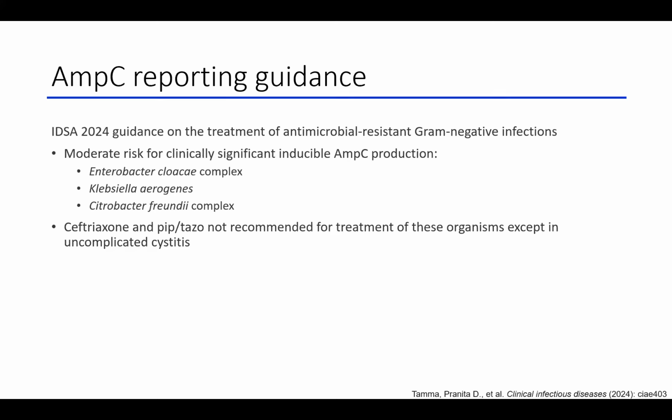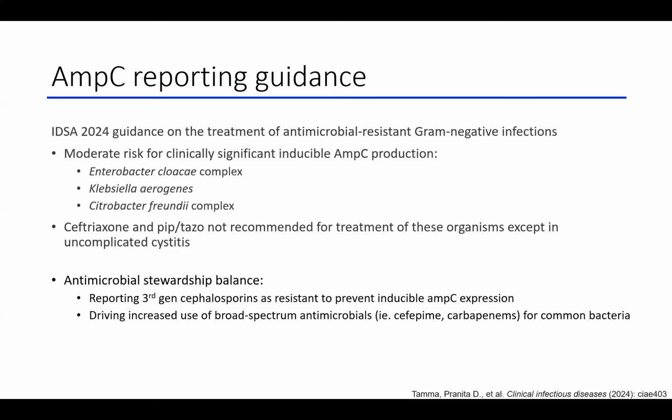So that goes to show that we treat the specific AMP-C containing organisms a little bit differently than the entire list, and that it definitely depends on the source as well, where we would restrict use of the third generation cephalosporins. And I think this is a good example of antimicrobial stewardship balance and collaboration with the clinical lab, because it really is a balance.